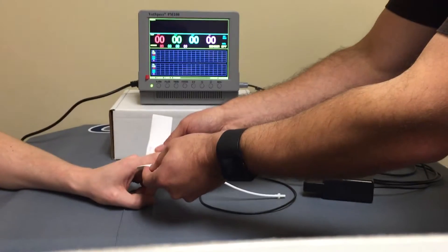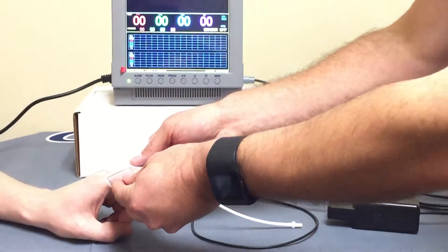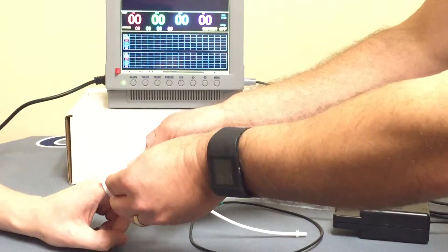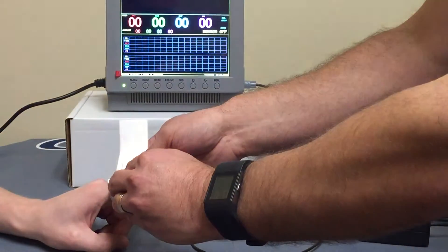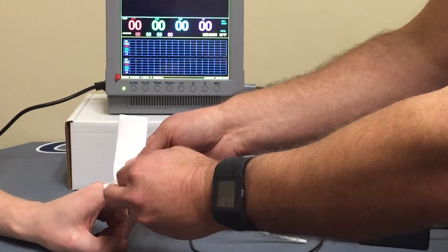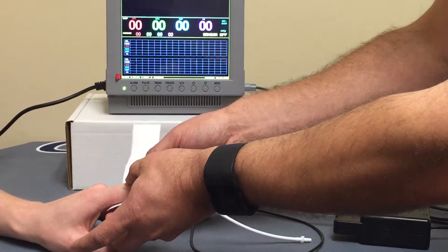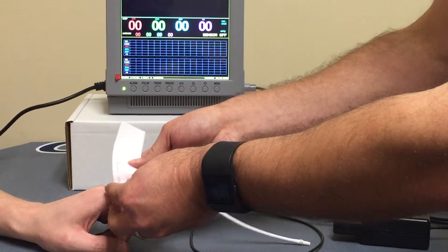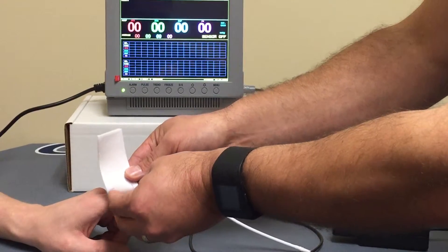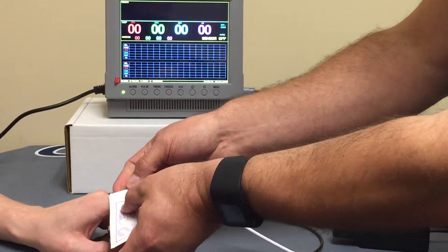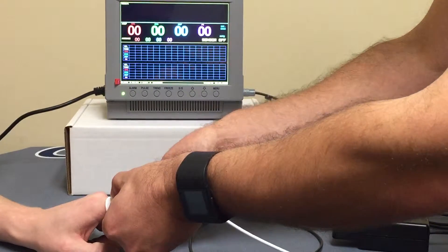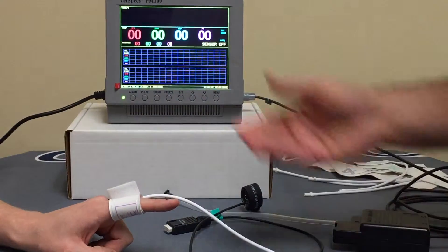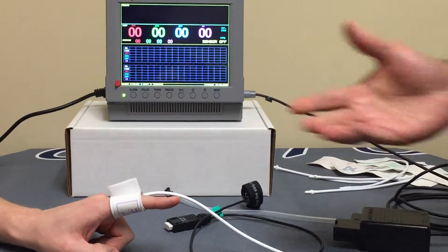All right, so occlusion cuff—we're then going to have the word artery on the bottom side of the finger. Wrap the top, the short side of this cuff around the top of the limb. This is called the index edge. We want to make sure that this index edge falls in between the range on the cuff marked on the inside, and that's how we know this is going to be a perfect fit for this index finger. When you wrap the cuff around, just want to make sure to wrap it as evenly as possible so that it's not lopsided, and that's going to help to ensure good occlusion. That is the job of the cuff, to occlude arterial flow.